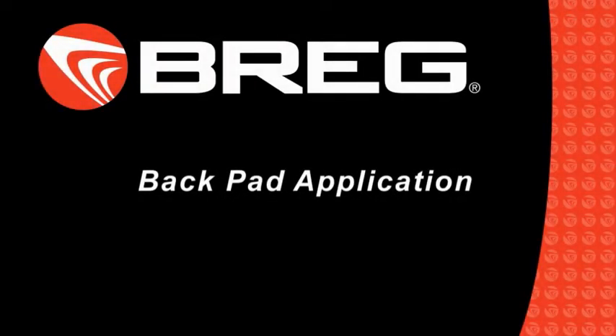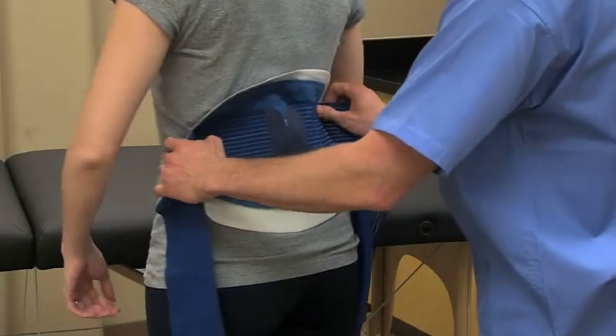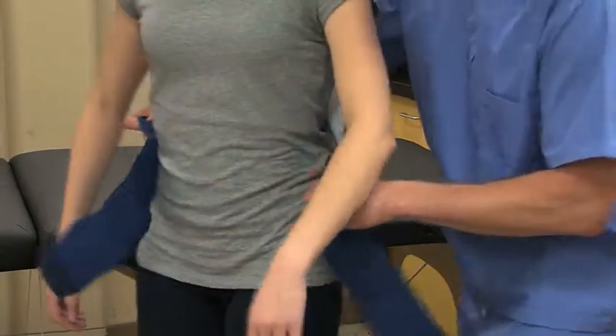This video explains how to properly apply a PolarCare BackPad. Whether you're using a Breg IntelliFlow or Wrap-On Pad, the simple application steps are the same.